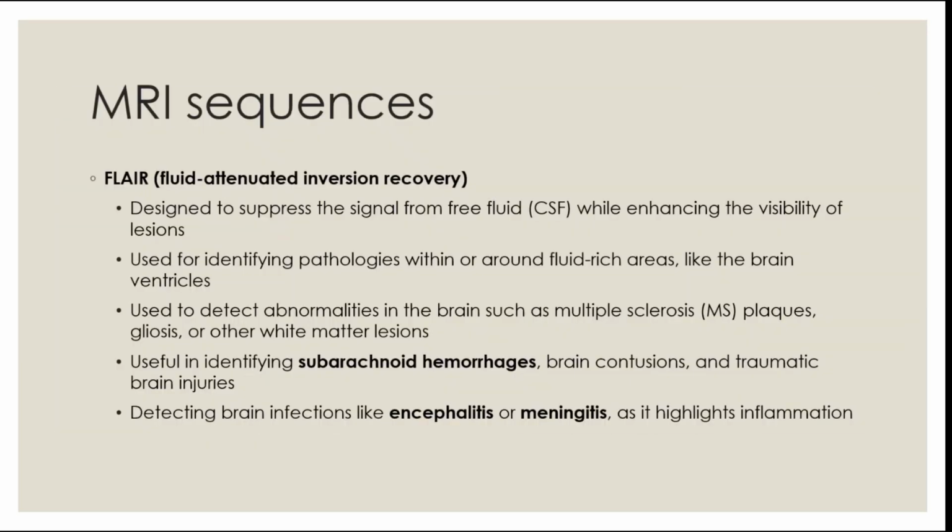Yeah, there's another sequence which is called FLAIR. I think you will hear about it in the neuroradiology seminar, which is fluid attenuated inversion recovery. It suppresses any signal that is coming from water in general, free fluids. So you can see fluid-rich areas better.